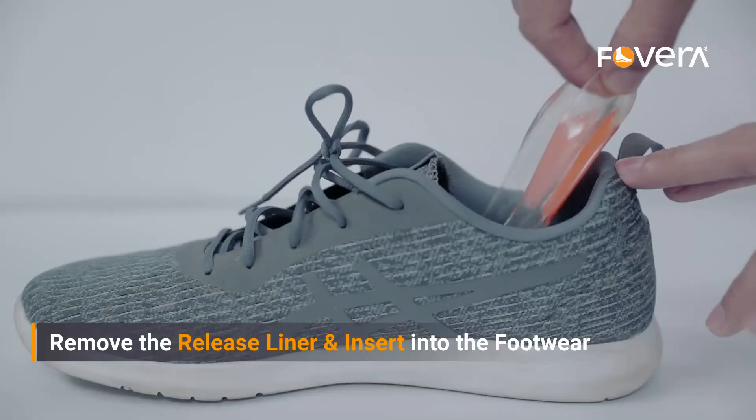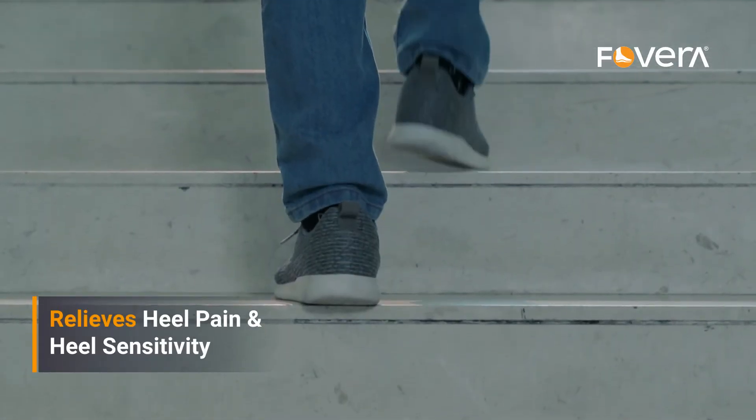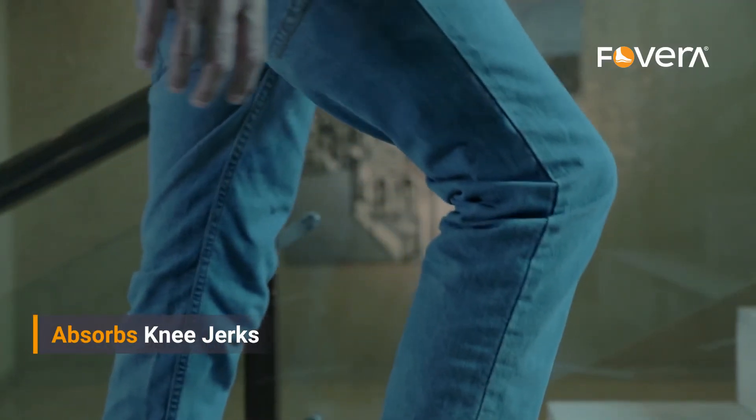This Fovera Heel Cup supports your heel through every step you take by redistributing heel pressure. It relieves heel pain and heel sensitivity. It also saves your knees from knee jerks. It fits in shoes and loafers and is available in both male and female sizes.